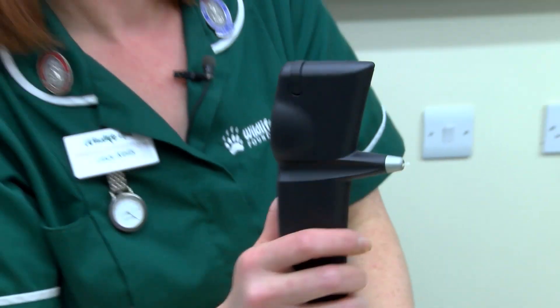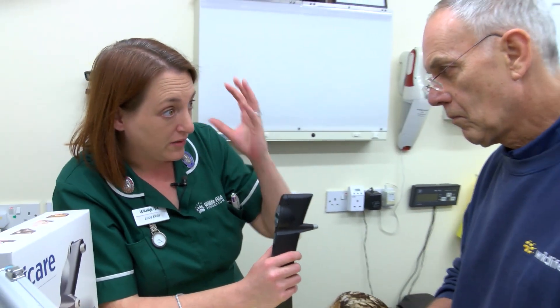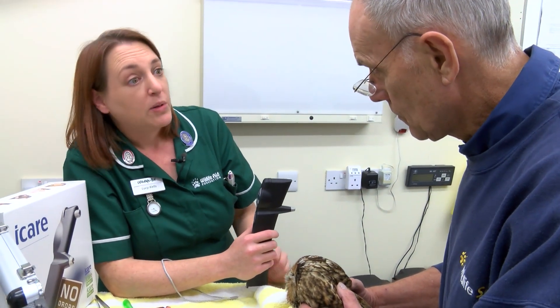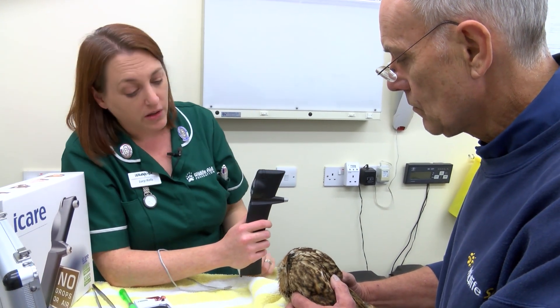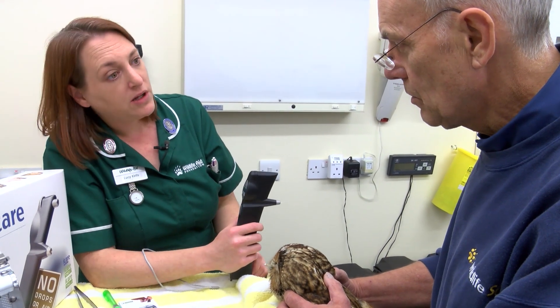That's good, and what that's told us is that that eye has no high pressure in it. It's almost exactly the same as the other eye, so we know that he hasn't got any kind of glaucoma issues happening. He's still got the blood in that eye, but at least we know that the blood isn't blocking any of the normal eye drainage and causing glaucoma pain to happen — so that's really, really good.